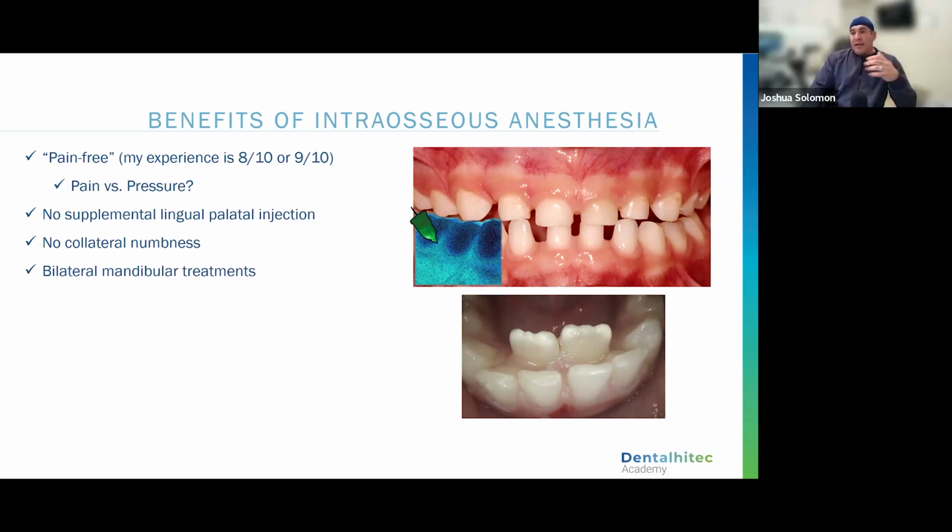Bilateral mandibular treatments. I would never think about giving a bilateral block. I think it's somewhat cruel for a child, and now I'll do bilateral mandibular treatments all day, every day. Far fewer appointments. When we say immediate action, that is one of the magic responses that you get with intraosseous local anesthesia: once you finish that injection, the needle comes out, you pick up the handpiece, and you start working.